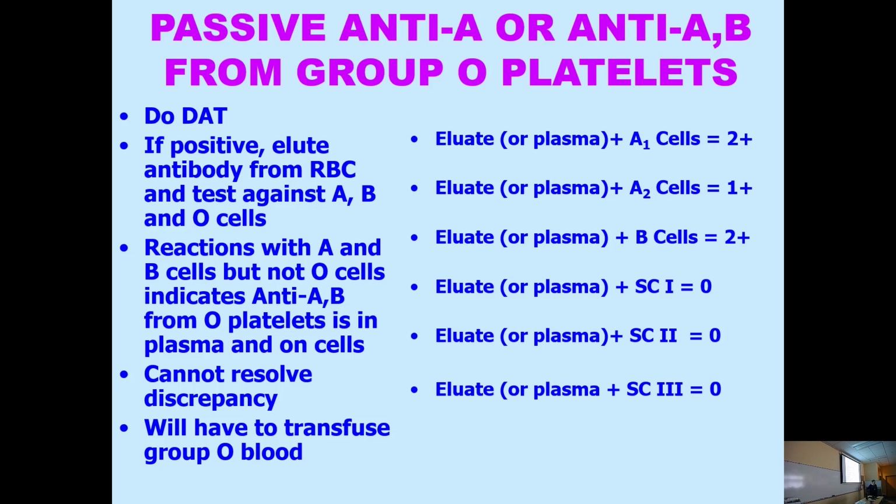Most of the time, instead of doing all these things, you're going to say, yep, they got platelets, give O blood. Okay? Most of the time, you're not going to have to do all this. Very, very seldom will anybody ask you to do all that because that's a lot of work. And the patient, we know what's causing it.